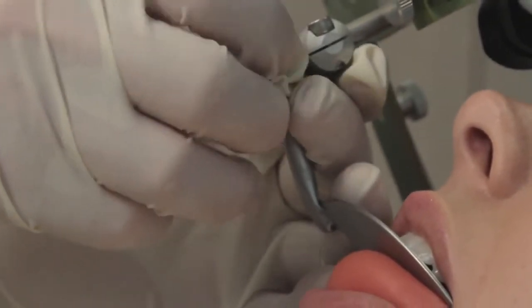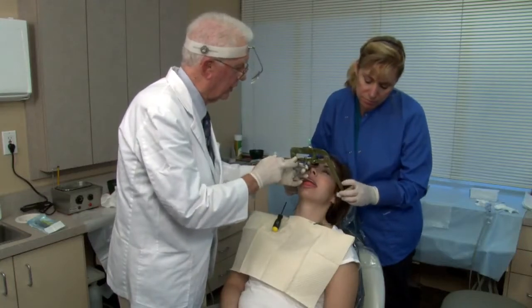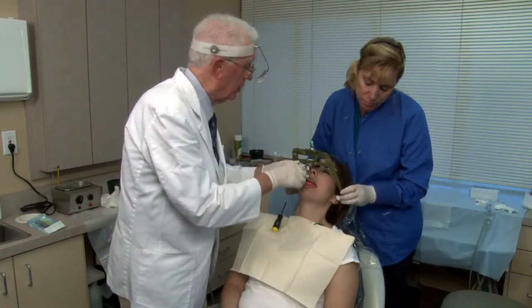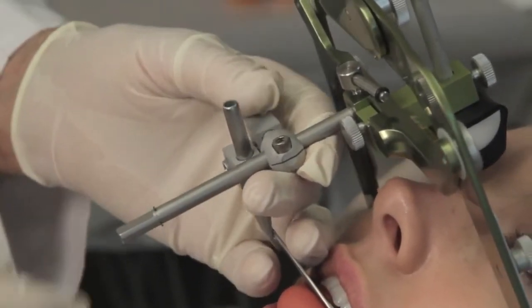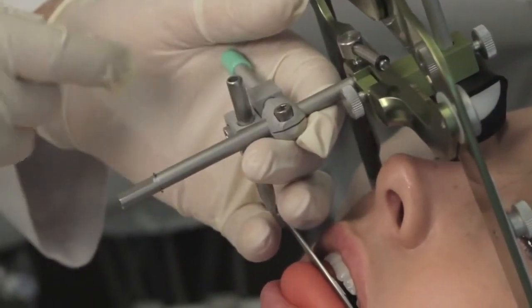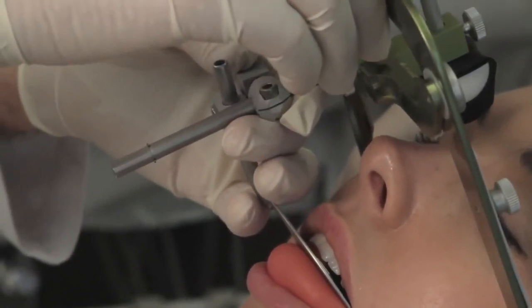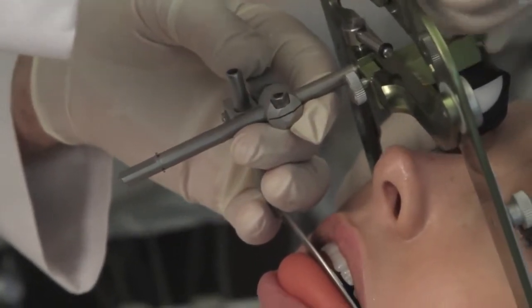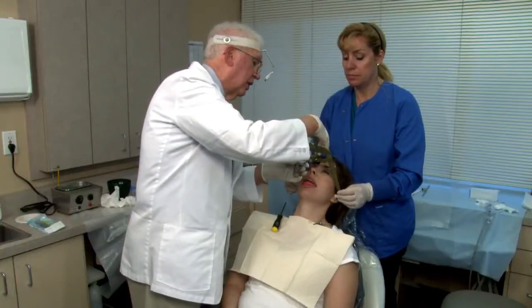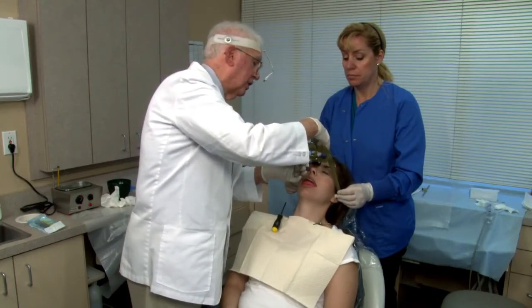Notice how I am controlling the bite fork assembly in the front with my left hand, keeping this at right angles, this vertical, and trying to control the vertical dimension at the same time. Once we have it controlled, I lock the width. Now I'm going to set the Nasion relator.